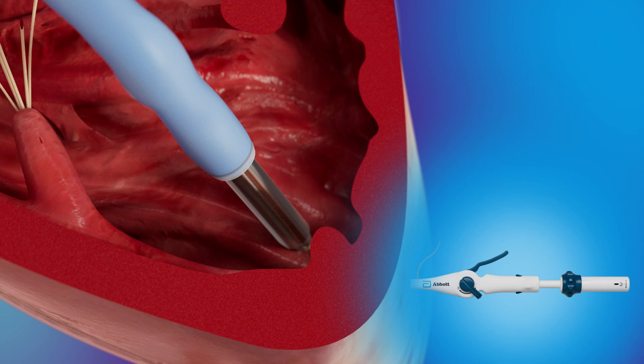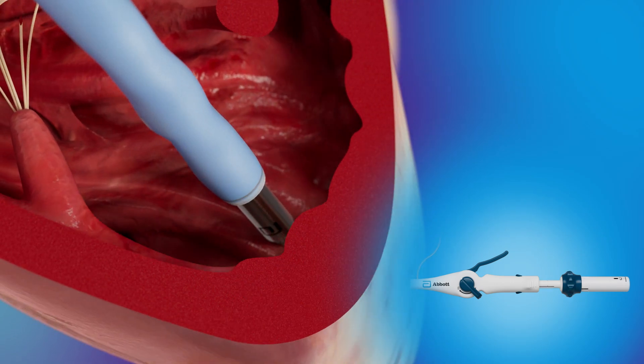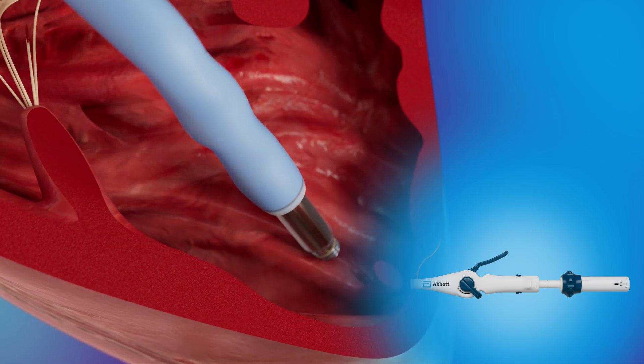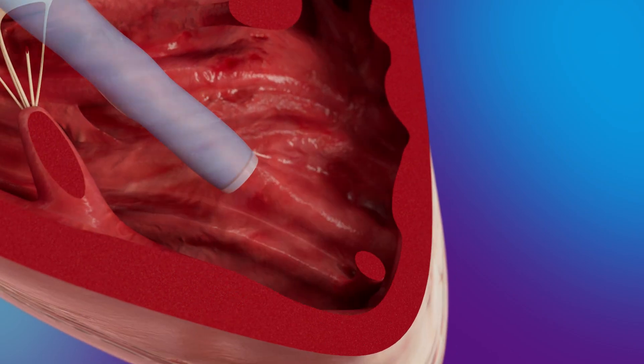The snare control handle is slowly turned counterclockwise to unscrew the LP until at least three full turns of the LP chevron are observed. Then the protective sleeve is advanced to fully cover the LP helix and the retrieval catheter is removed from the heart.